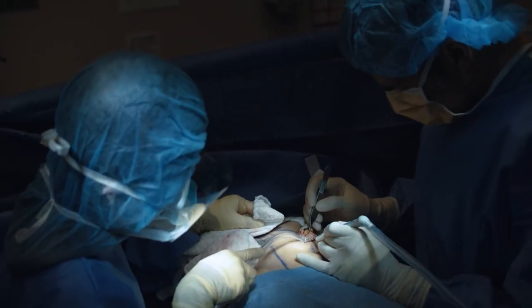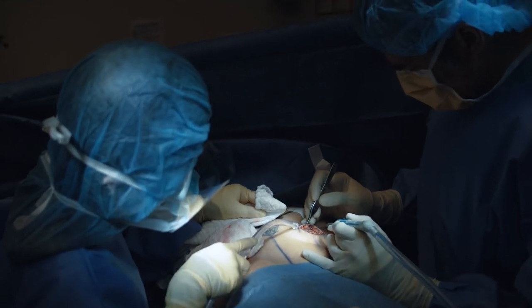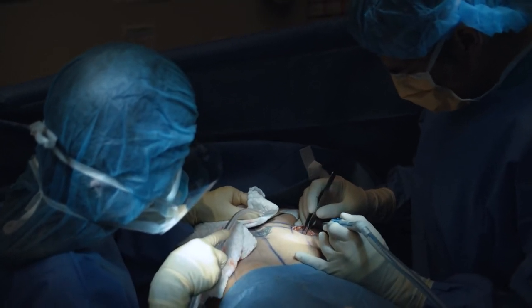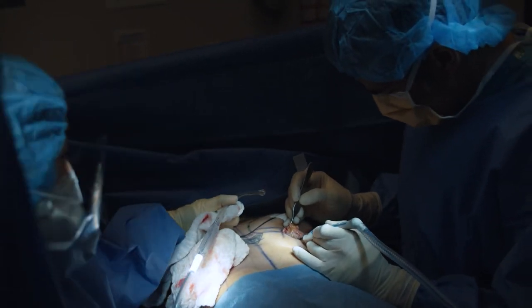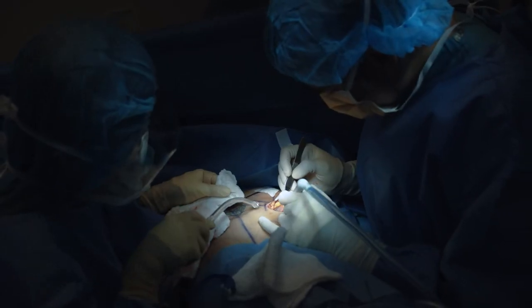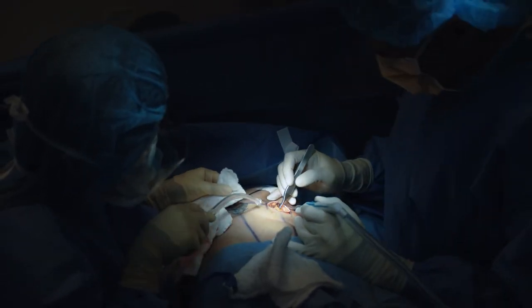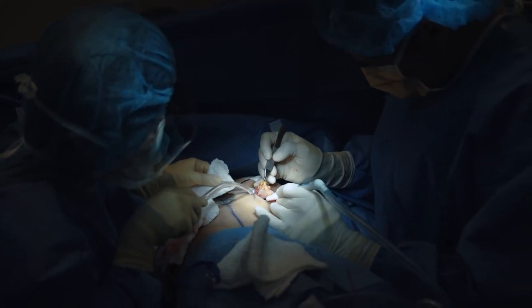And here we've identified the pectoralis major muscle. We went through skin, subcutaneous flap, breast gland, and now the red fiber that we're seeing is the pectoralis major muscle that we're identifying. And dissecting the breast gland off the muscle to identify the muscle and release it.